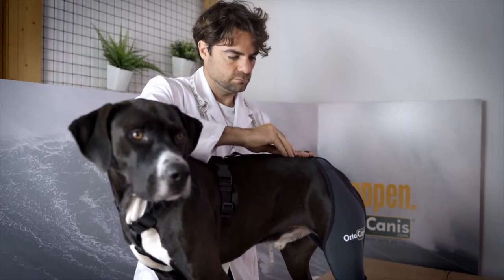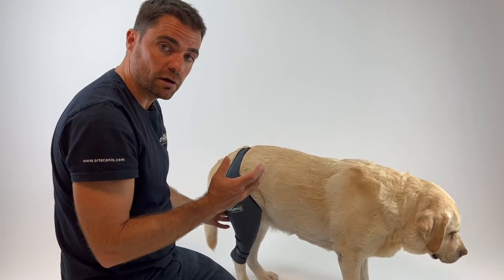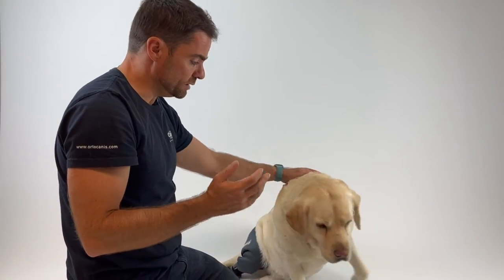Remember to check all the parts that are attached to the body of the dog to check for illness or any possible reaction, and be sure that your dog is safe.